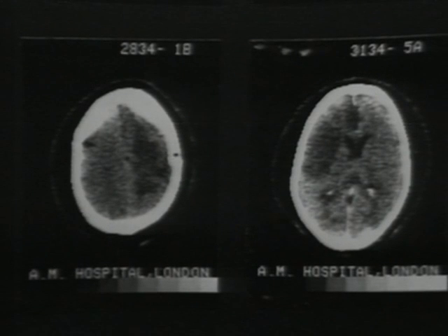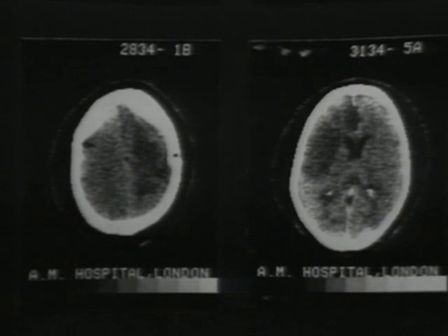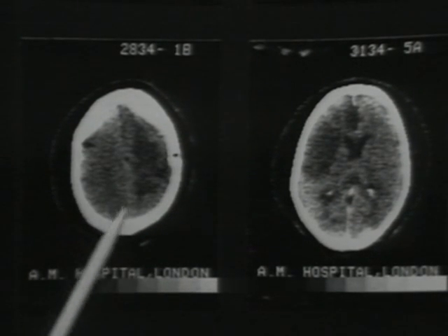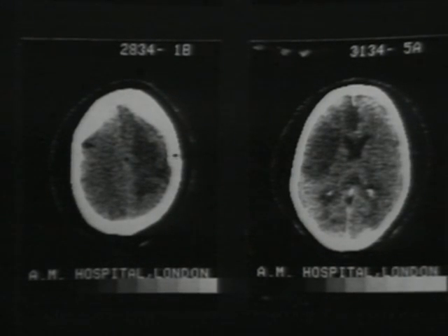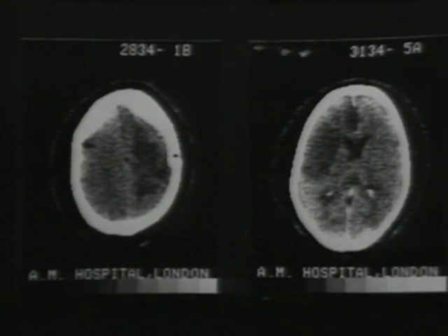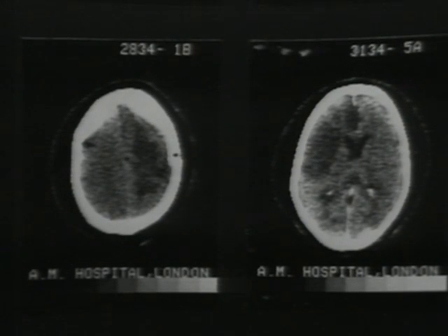In other scans, we may see changes which we are unable to interpret in terms of precise pathology. Now, in these two scans here, we can see dark areas which may or may not indicate edema, and we require to know a little bit more about the patient. Now, in most cases, we usually do. For instance, if this patient here had an empyema of the lung which was drained, and then later on became very ill, developed a left hemiparesis, we would suspect that she might have developed a metastatic abscess in the right cerebral hemisphere.